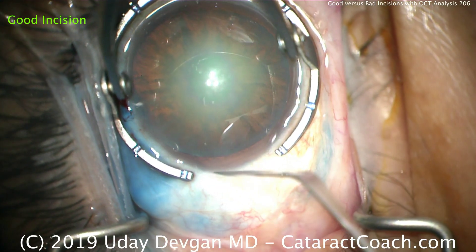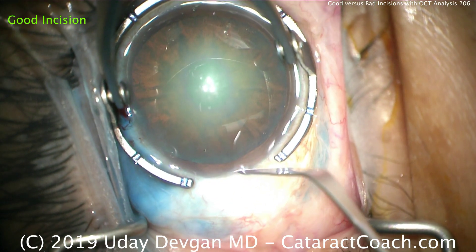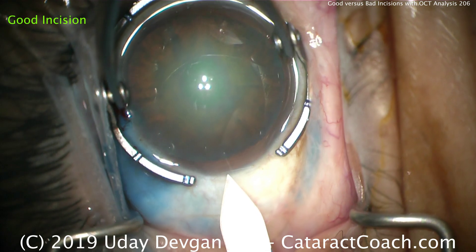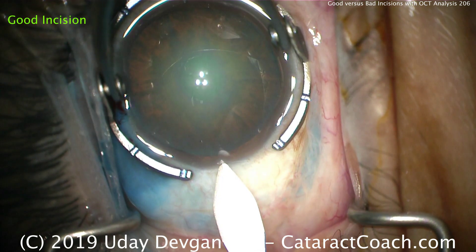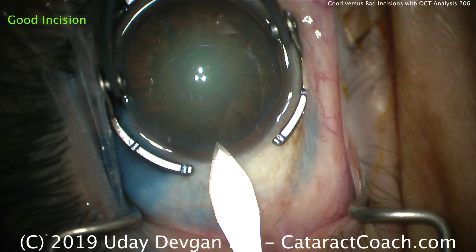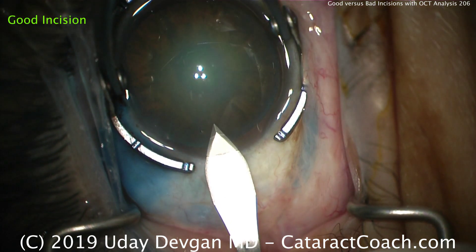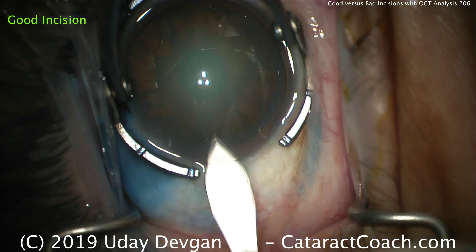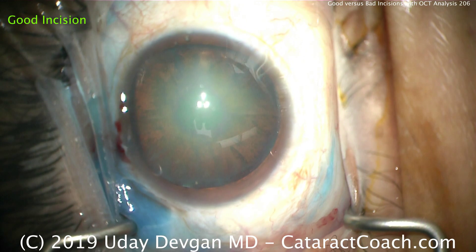Let's go back one more time to the good incision. In this technique, there's a light groove — only about 100 microns. Starting the edge of the keratome right there in the stroma, angling it down ever so slightly to achieve an appropriate tunnel length, then going all the way in and coming out. Again, that's a nice incision.